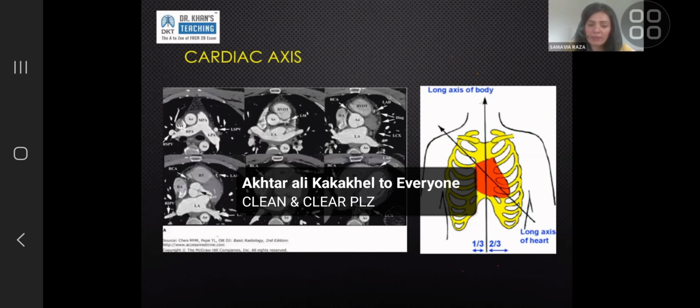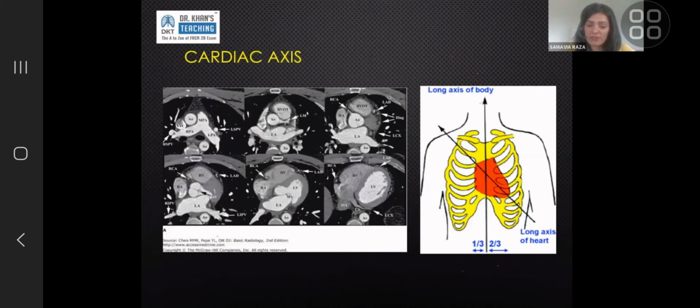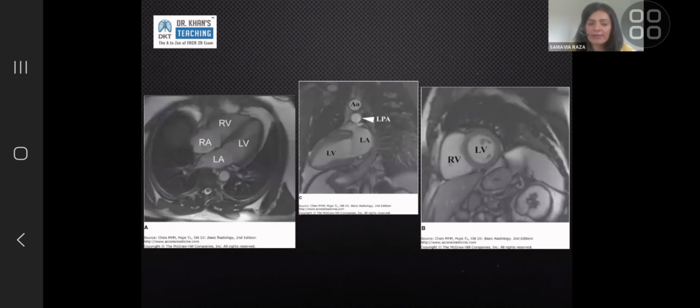So what you think might be cardiomegaly, or a specific chamber that may be enlarged on a specific slice on a CT, wouldn't really be accurate, because the measurements or normal values we use in cardiac imaging are based on echo, and all those images are acquired along the axis of the heart and not the body. The images that we acquire on echo across the world form the gold standards we still follow. Even for MR, we use the normal values that were developed based on echo.